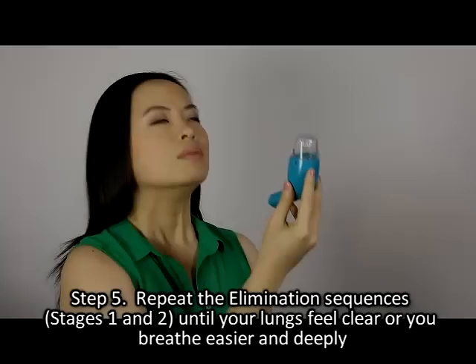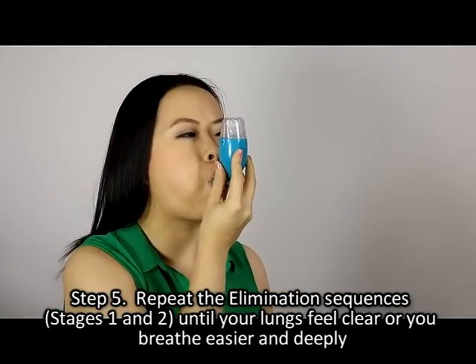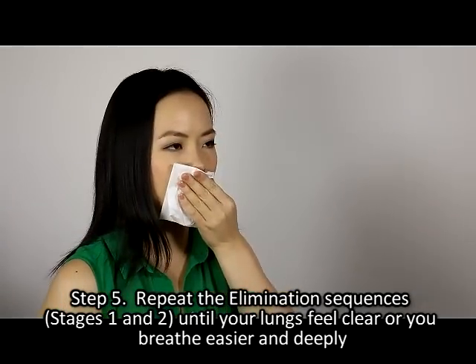Step 5: Repeat the elimination sequences of stages 1 and 2 until your lungs feel clear or you breathe easier and deeply.